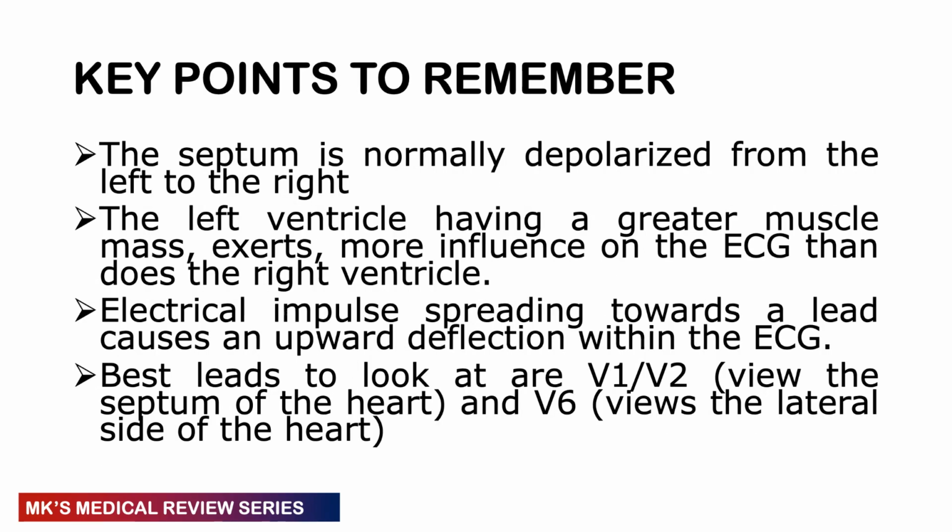So key things to remember, which I did talk about in the previous video, they do apply for this video as well. So number one, remember your septum is going to be depolarizing from the left side, going towards the right side, then eventually moving towards the apex of the heart, then the lateral aspects of the ventricle. The left ventricle has a greater mass than the right ventricle, so meaning it's going to have a greater influence on the ECG than the right ventricle under normal circumstances.